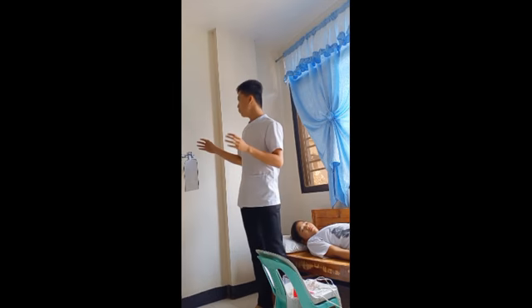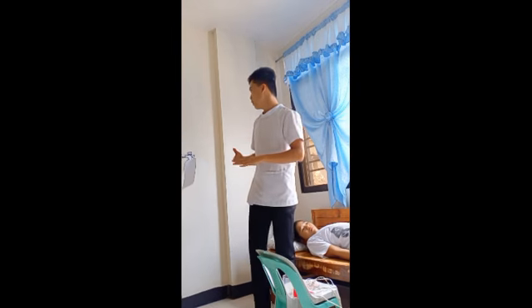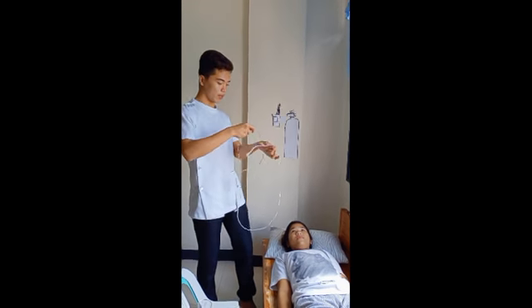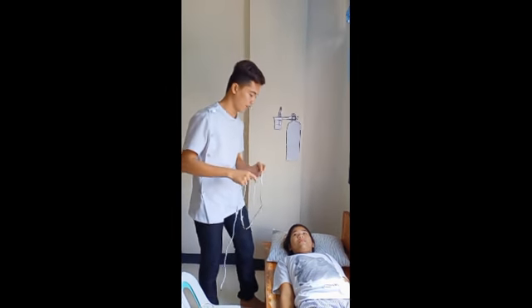First, the oxygen tank is used in hospitals when you have difficulty in breathing and you need to be confined in the hospital. And this flow meter is used to check the correctness of the flow. So like this, I'm going to show the purpose of the nasal cannula.